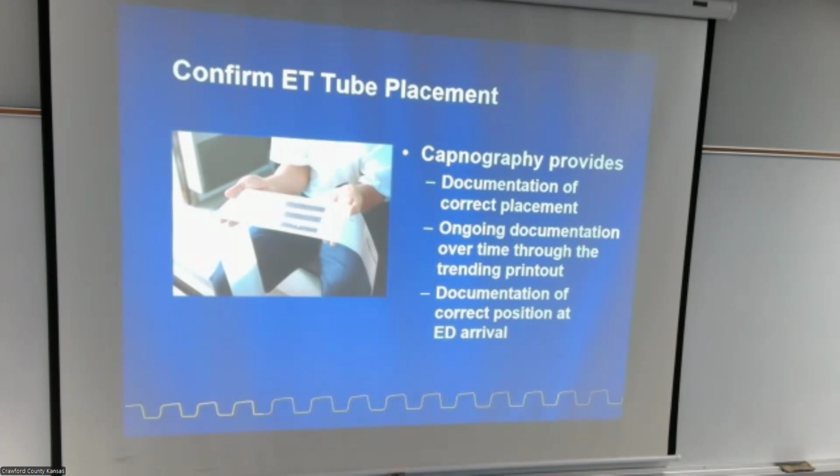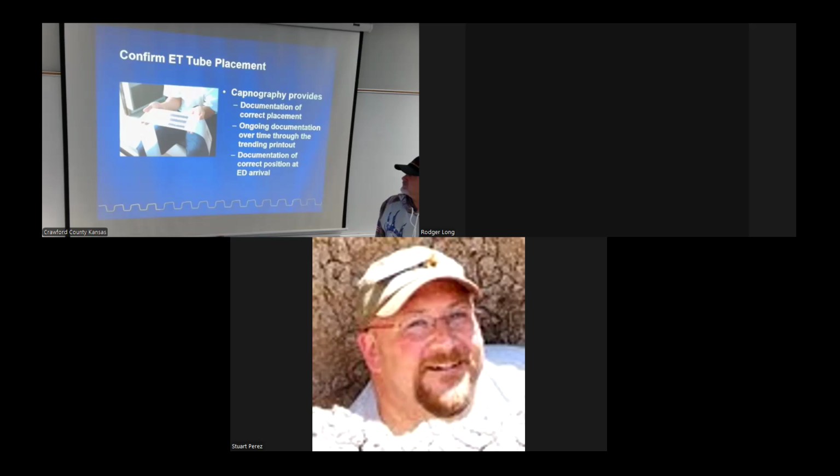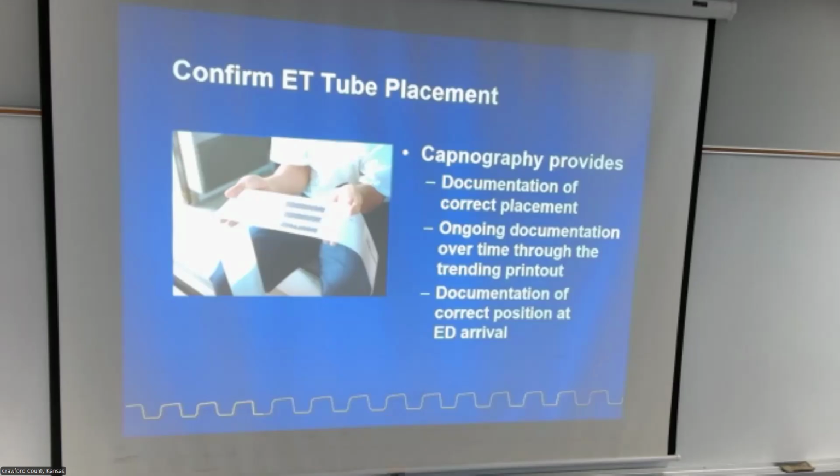Also provides documentation of correct placement of your ET tube, ongoing documentation throughout your patient care. You can print out any kind of trend on there to prove that tube is in place from point A to point B, and the ER pulled it out when they moved it.